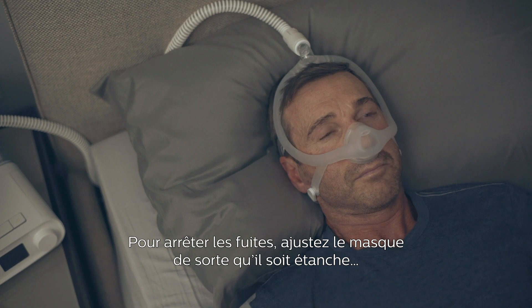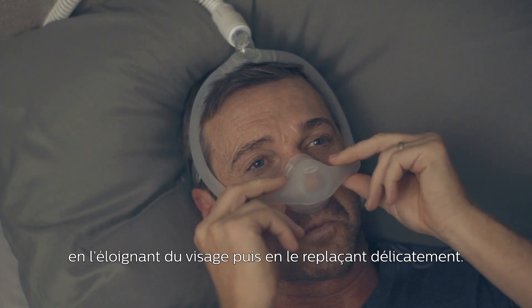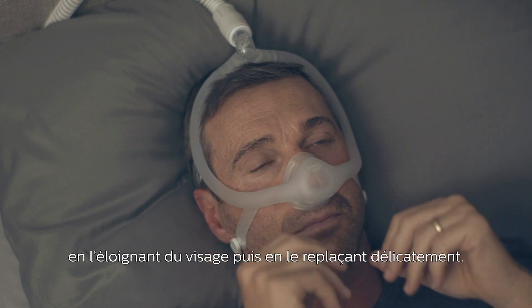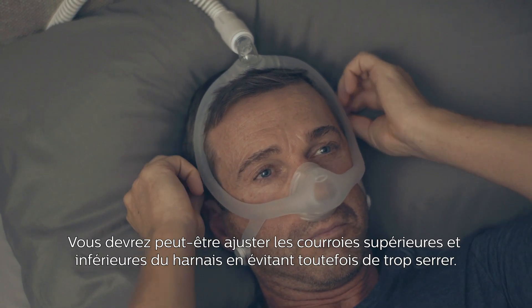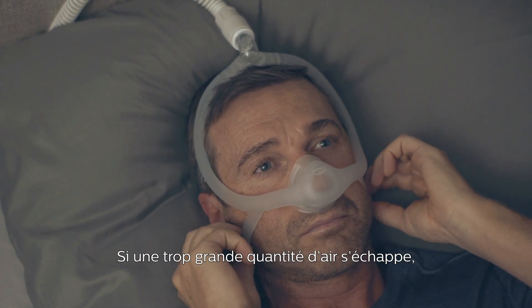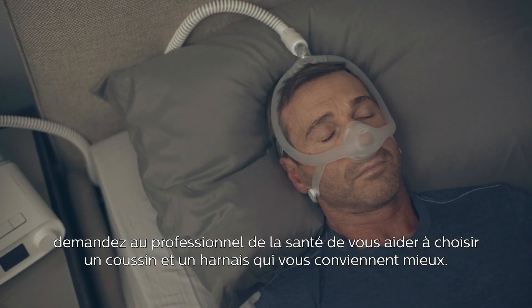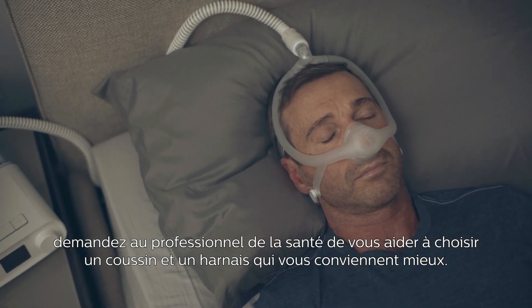To correct a leak, try re-seating the mask by pulling it directly away from your face and then gently setting it back into place. You may need to adjust the top and bottom straps, but avoid over-tightening the headgear. If too much air is escaping, ask your health care provider to help you find a cushion and frame size that is a better fit.